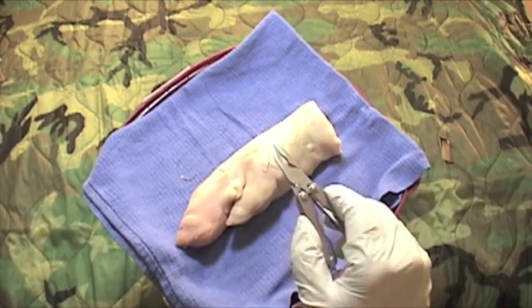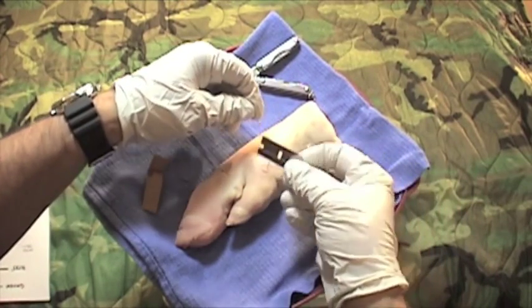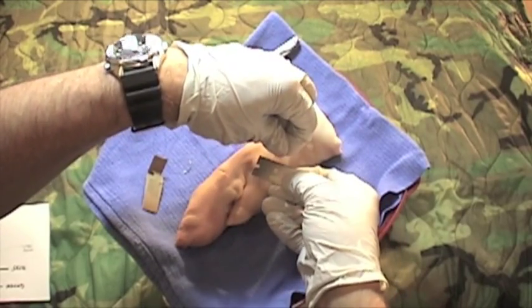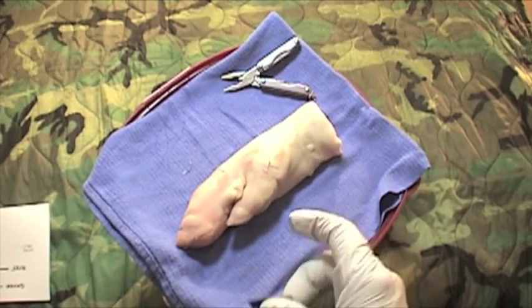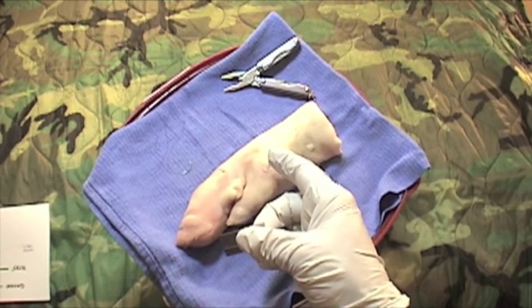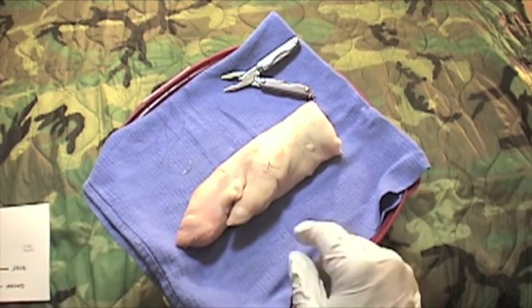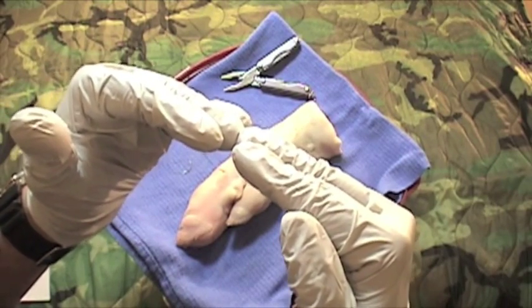I've got one suture in place. Let's get the razor blade out — keep the sharp edge up away from the person you're working on. Cut, and cut, and cut. Some things to keep in mind: don't tie these super tight. You don't want to strangulate the skin, which is going to cause complications that ultimately result in infection. Should be brought together cleanly, but not tight. Don't strangulate.